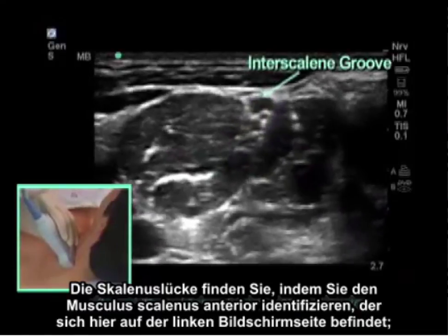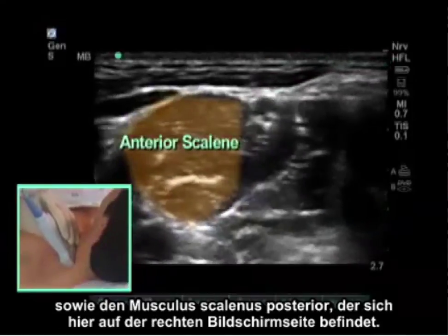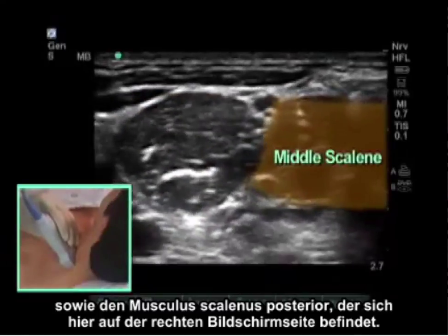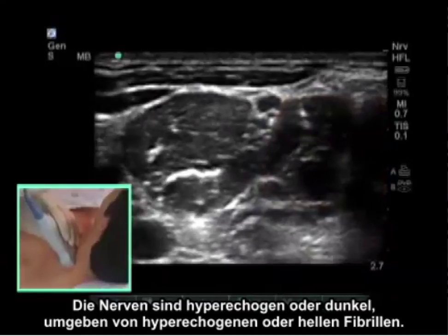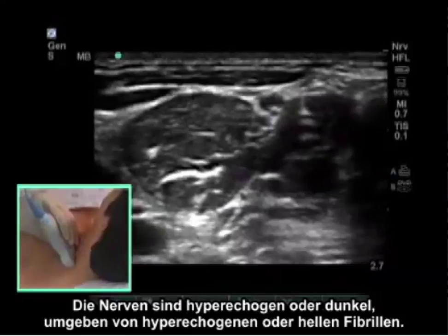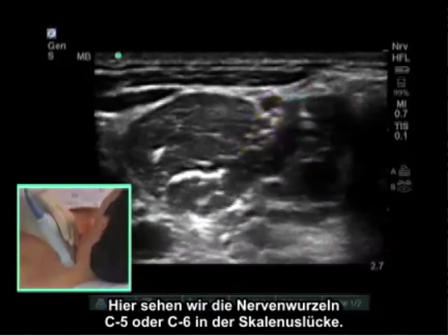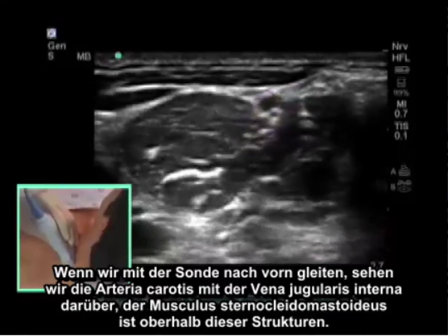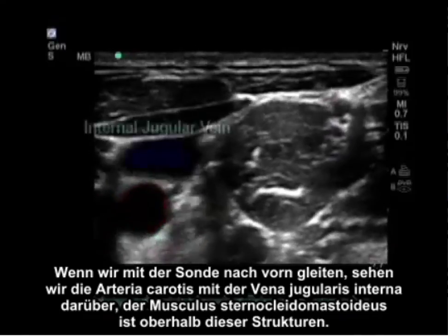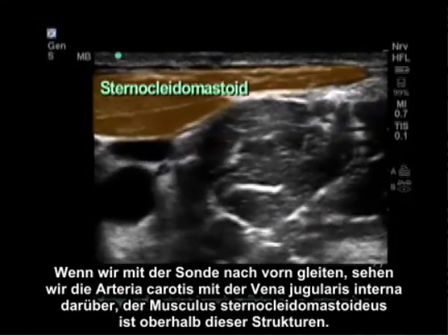The interscalene groove is found by identifying the anterior scalene muscle anteriorly — here to the left of the screen — and the middle scalene muscle posteriorly, to the right of the screen. The nerves are hypoechoic or dark, surrounded by a hyperechoic or bright fascial covering. Here we are looking at the C5 and C6 nerve roots in the interscalene groove. If I slide the probe anterior, we get a carotid artery with the internal jugular vein on top of it, and the sternocleidomastoid is above these structures.